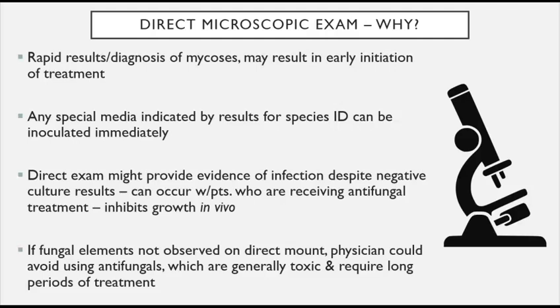Direct examinations can provide evidence of infection even though culture results may be negative. Negative results from culture sometimes happen with patients who are already receiving antifungal treatments. It inhibits growth in vivo, meaning inside the organism or inside the person. If fungal elements are not observed on direct mount, the physician could avoid using antifungals, which are generally toxic and require long periods of treatment.